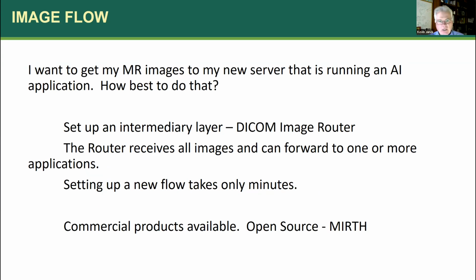So this is what we've done here, especially with CT exams at UAB. CT exams from the scanner go straight to PACS because we want to get them into PACS as quickly and efficiently as possible. So the modality sends the CT images to PACS, but then it also sends the CT images to this DICOM image router. And from there, I can send them to whatever application.